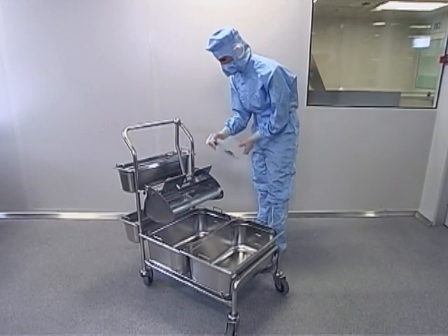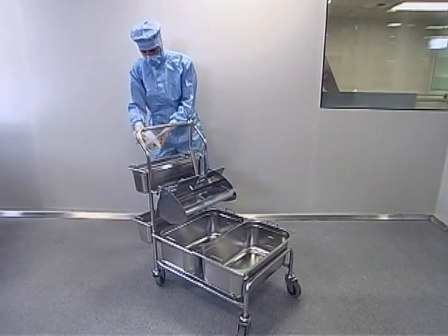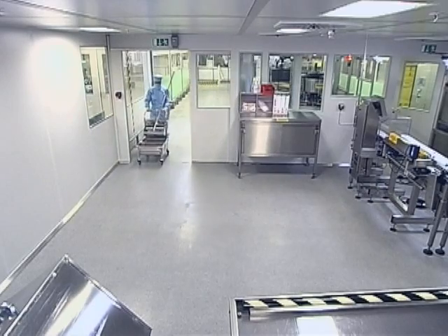Afterwards, the cleaning system trolley can be disinfected completely with, for example, an alcoholic spray disinfectant. Now the cleaning system trolley is ready for the next use in the clean room.